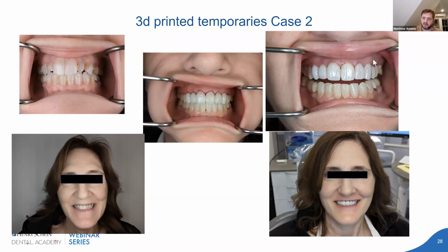and we place the implant on number 12. It's integrating, but she doesn't have any dental space. We just put a temporary bridge over there, and we'll restore that individually later.